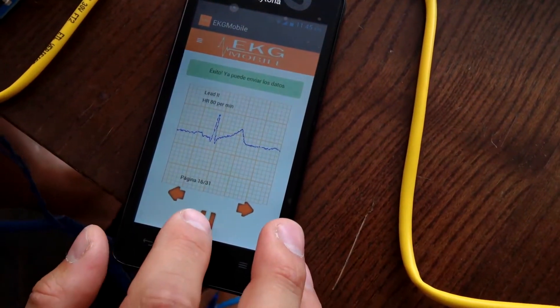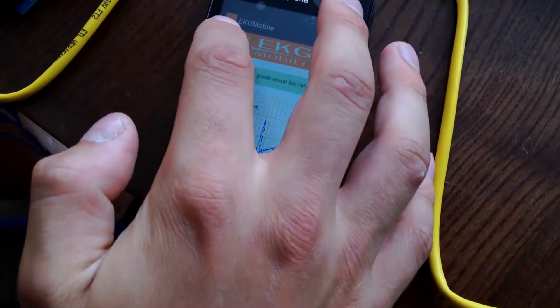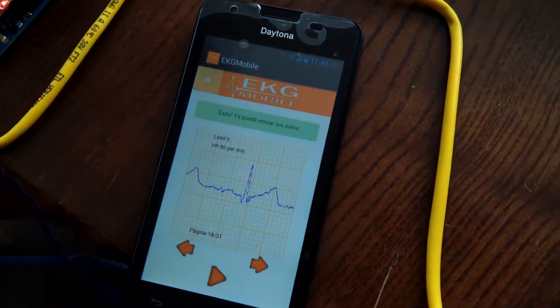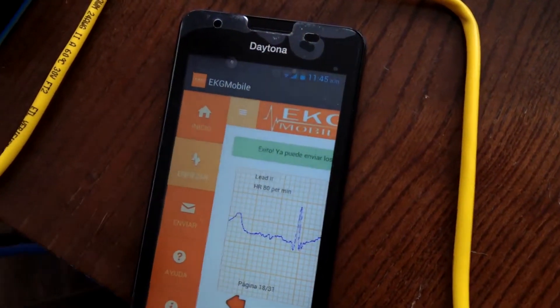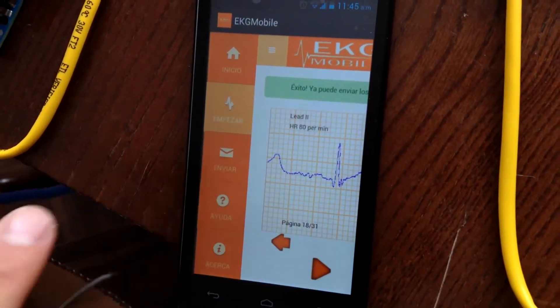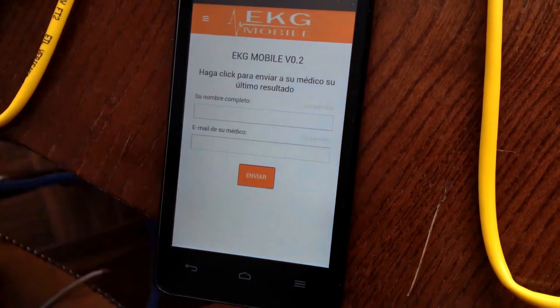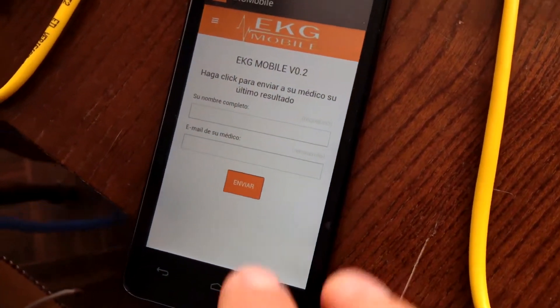To send the information to the doctor, we click on the menu and Send. We input the patient's name and the doctor's email and click Send.